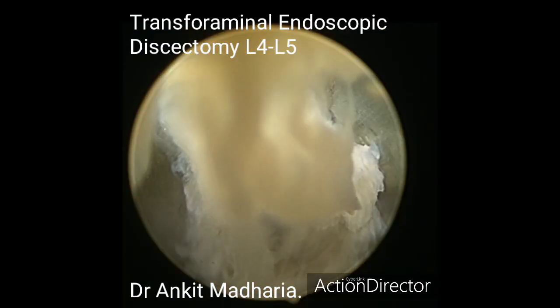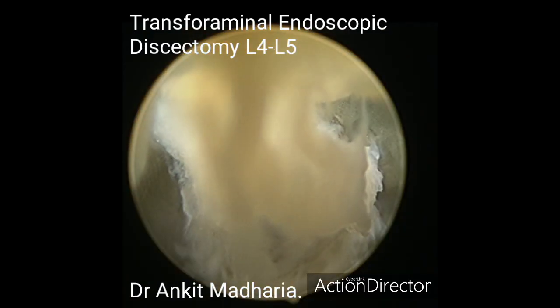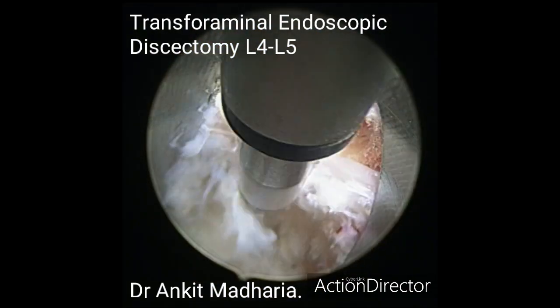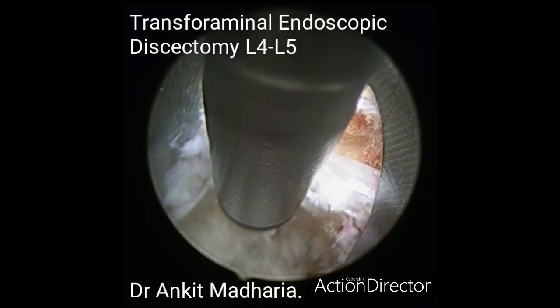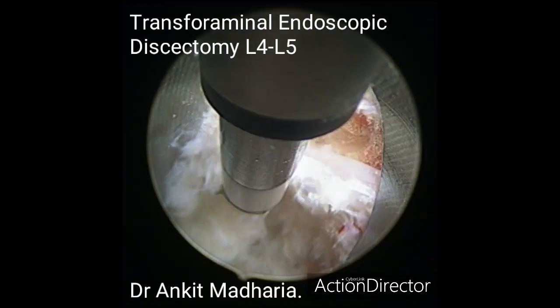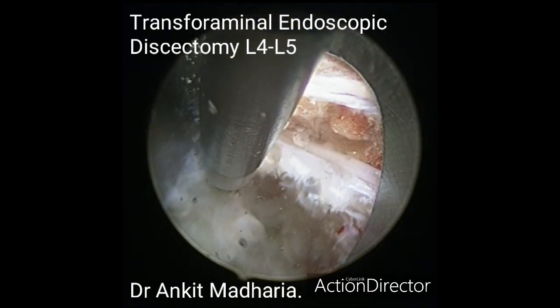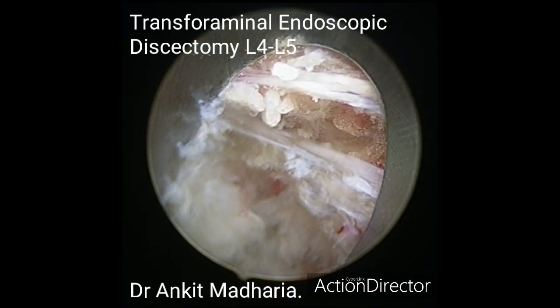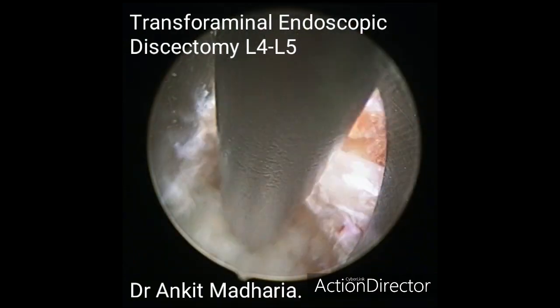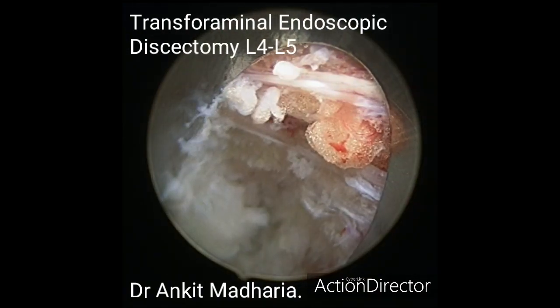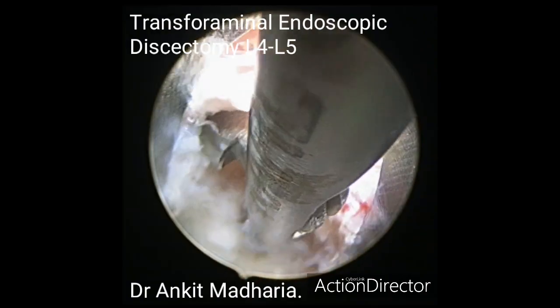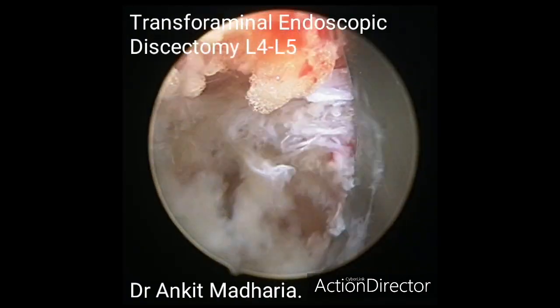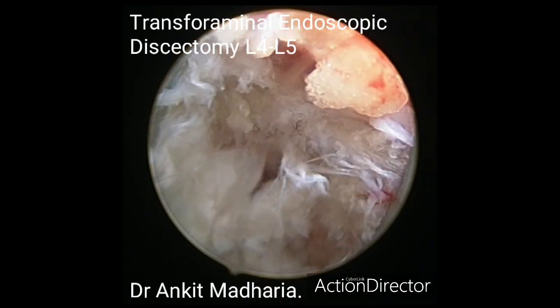After achieving intradiscal decompression, the cannula was withdrawn to show a half-in half-out view where you can see the bipolar probe working on the outer edge of the annular fibers. Further sub-annular decompression was achieved using graspers anterior to the annular fibers.